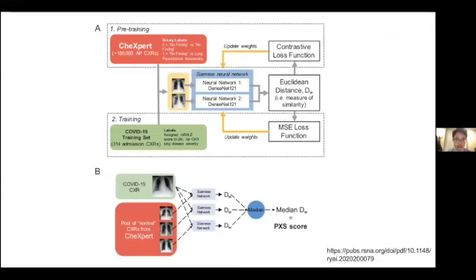I'm not going to get into the detail of how the algorithm actually works, but please feel free to read it in the paper or to email me afterwards. The basic gist is that we trained a neural network-based model. We pre-trained it on non-COVID chest x-rays from Stanford's CheXpert publicly available data set. And then we tuned that model on a subset of frontal chest x-rays from MGH, all in patients with COVID-19, who were assigned by 3 expert annotators a manual severity score from 0 to 24 based on a system of rules.